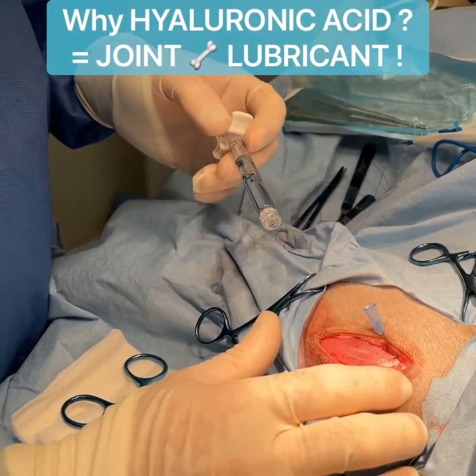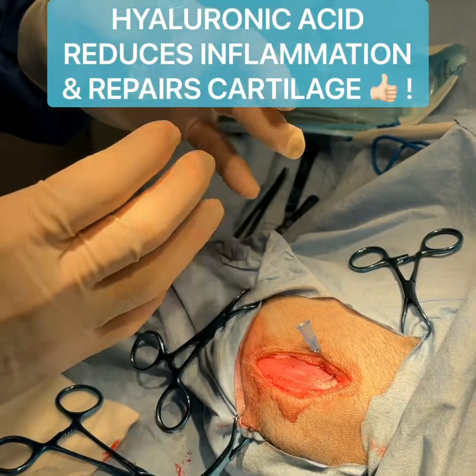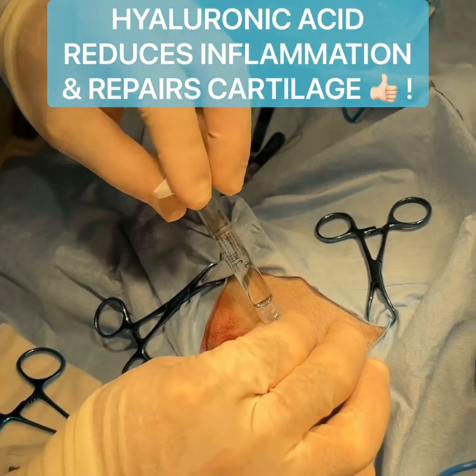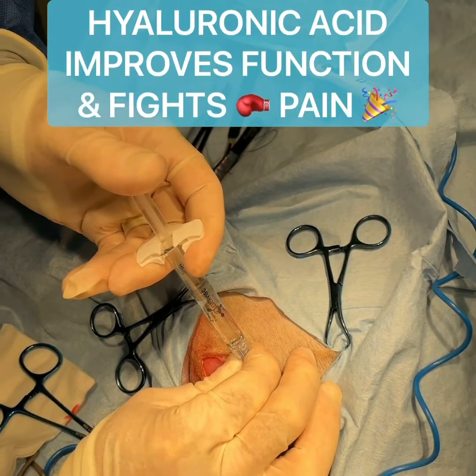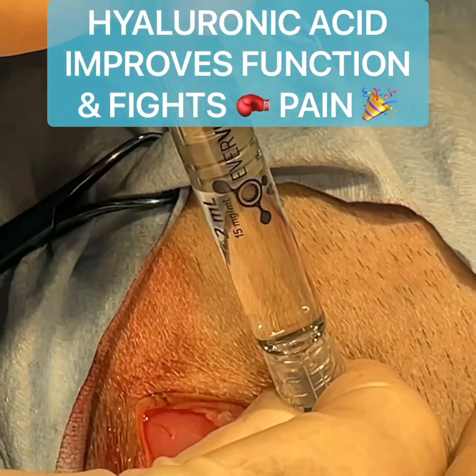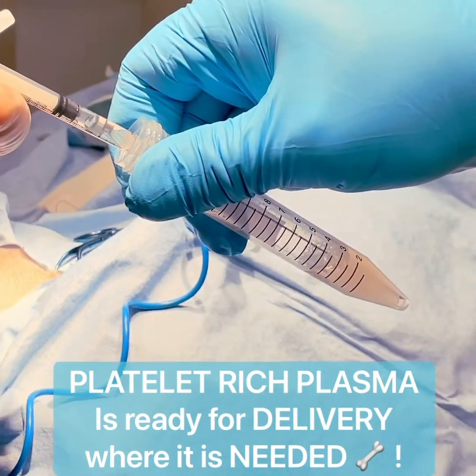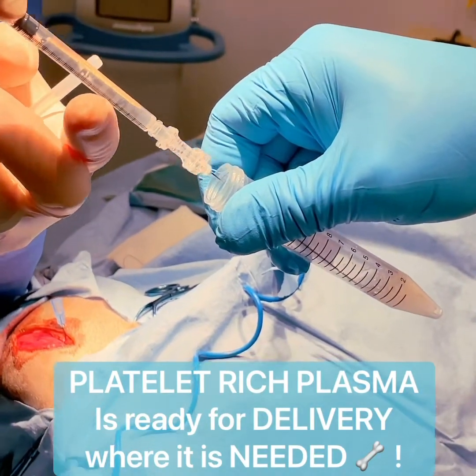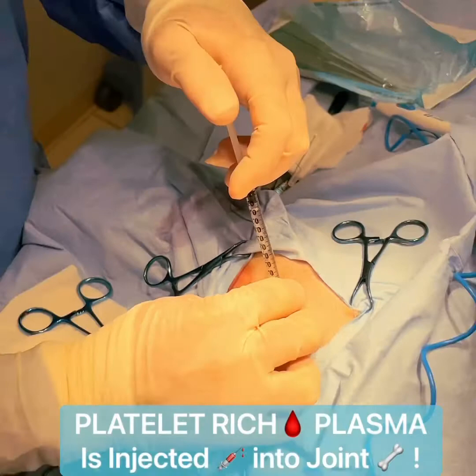We've already closed the joint capsule and cleaned out the OCD lesion. We're going to inject now what's called hyaluronic acid, which works almost as joint fluid to fill the joint. Then we're going to follow that with the platelet-rich plasma that we prepared previously. As you can see, this is very thick and it acts as a lubricant in the joint now that we've cleaned it out. We'll do one ml on this shoulder and another ml on the next shoulder.